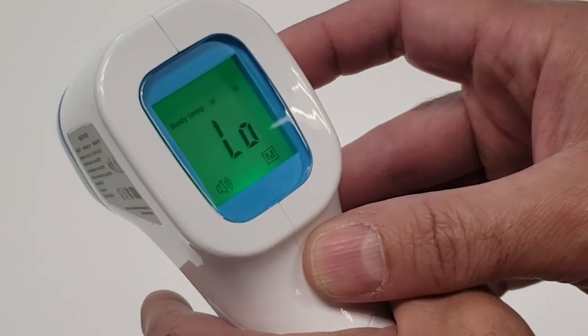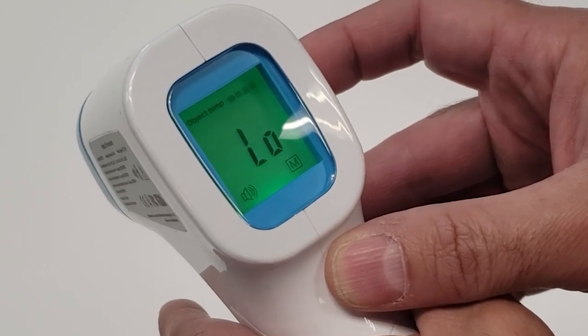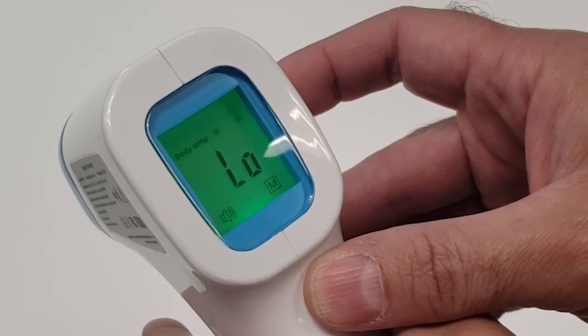Next is setting up the thermometer based on preference. To switch between body temperature or object temperature, press the Set button on the side of the unit.